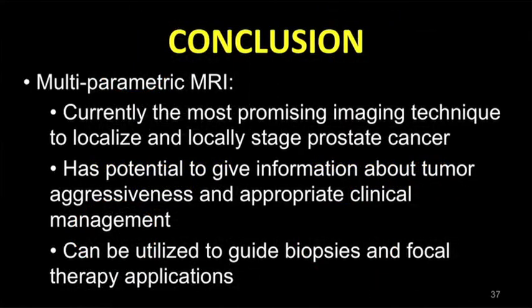So to conclude, multiparametric MRI is currently the most promising imaging technique to localize and locally stage prostate cancer. It has potential for information on aggressiveness and management, and it can be utilized to guide biopsies and focal therapy applications.